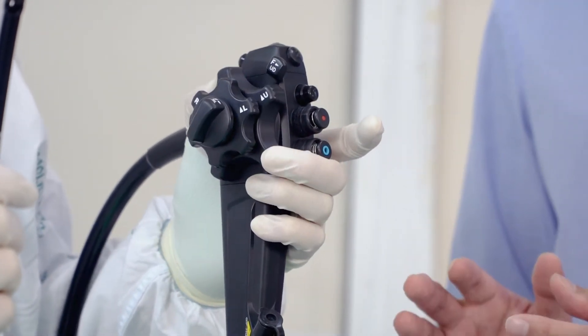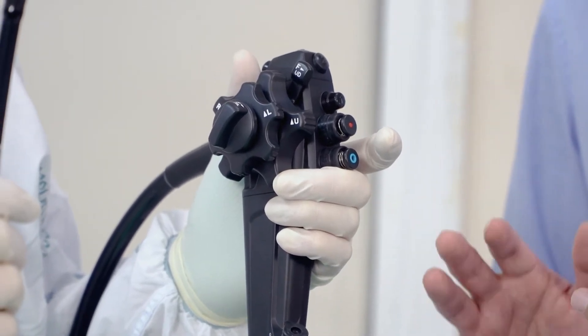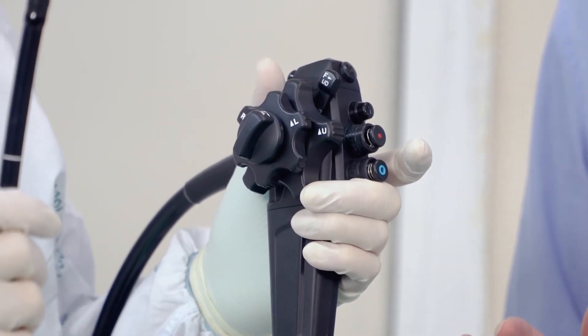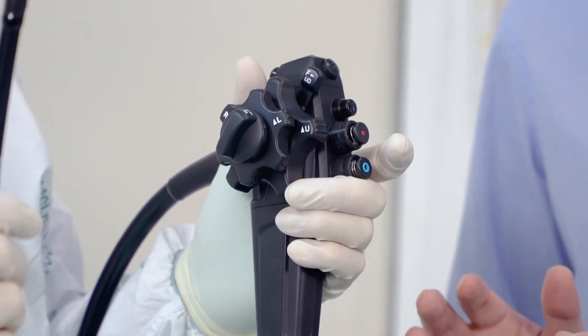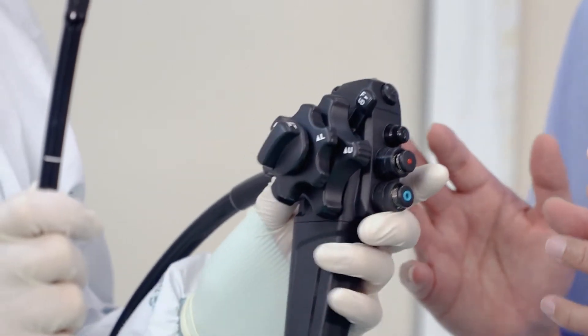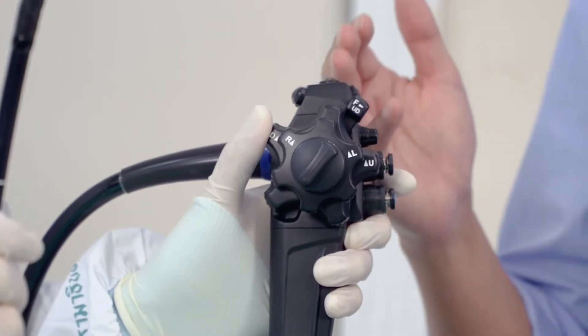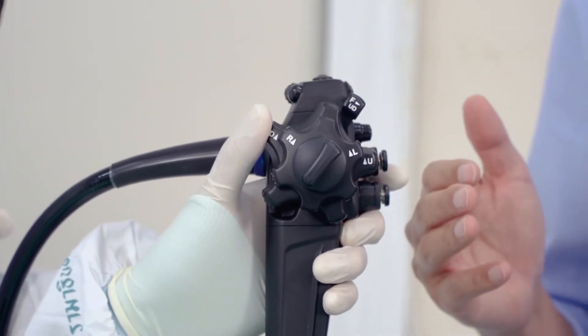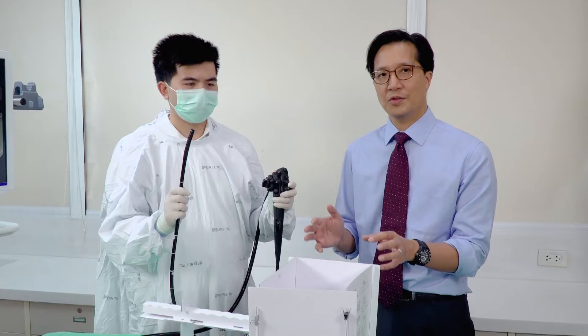If you have a smaller hand, it's not possible to do this, and if you try it makes it more difficult for you to control the small wheel. So you have to actually use your thumb more, and you do this by rotating your hand a little bit so your thumb is more in control of the large and small wheels. Once you're holding it correctly, we can then go on to use the Model One.